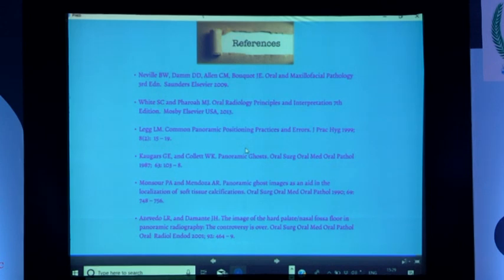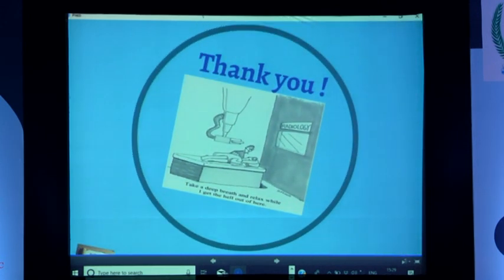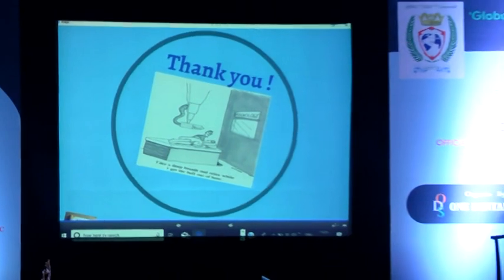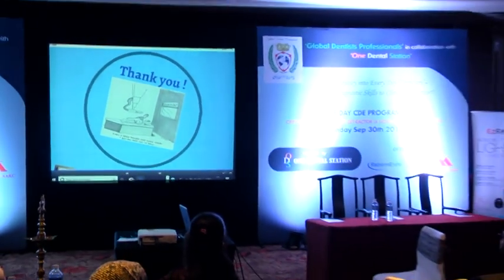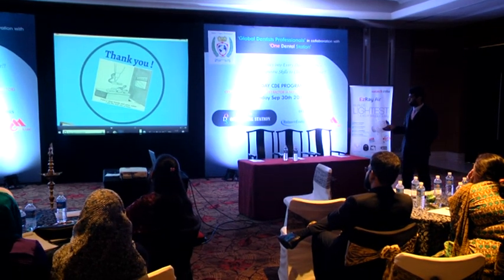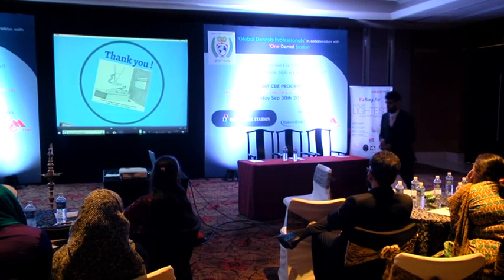Okay? Now to conclude, not too much interpretation is really required. The basic idea of the normal anatomy of the bony structures as well as the soft tissue structures is paramount in identifying any pathology. But too much interpretation can also lead to misinterpretation and will lead to misdiagnosis. Okay, that's about the first part of my odyssey. I think the second part I'll start in a moment.